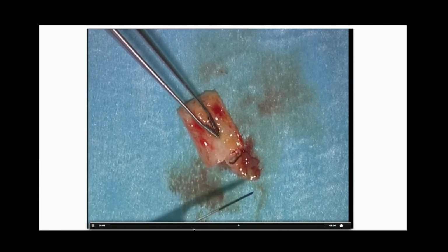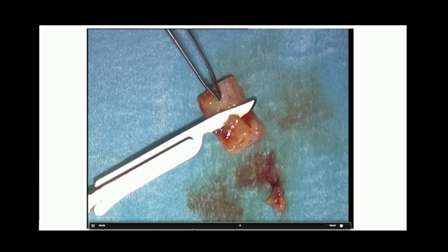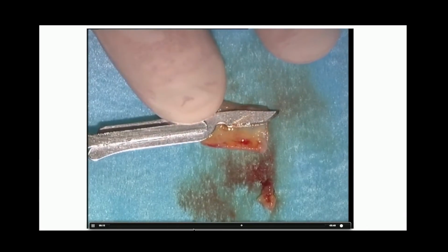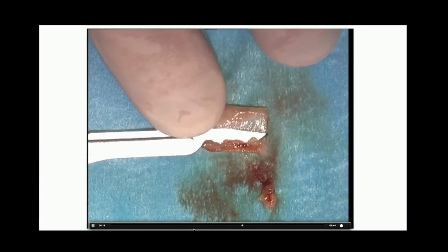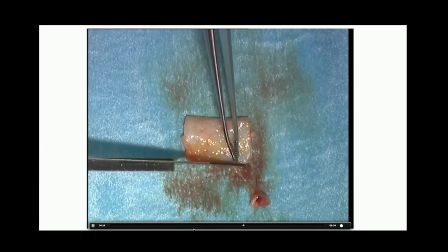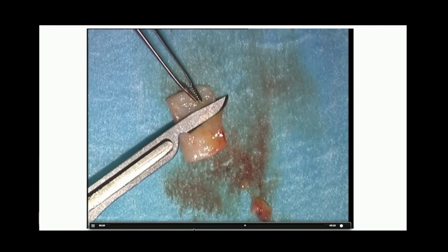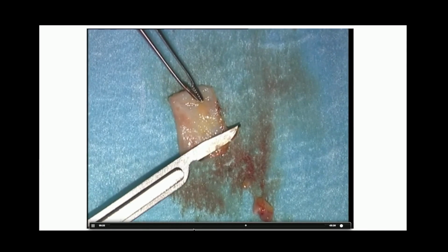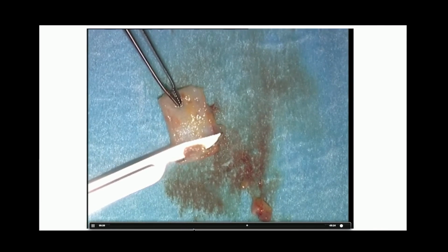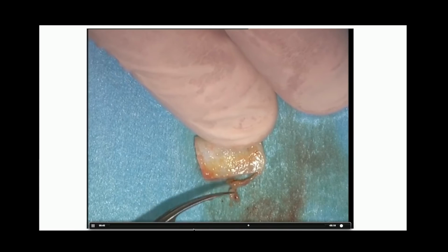As I mentioned before, the only real risk in this procedure, the risk of failure, is if we can't provide enough blood supply to the free gingival graft, and it ends up becoming necrotic. The only two possible mistakes are that I might not secure it properly and the suture could come loose, which would obviously mean losing the graft, or that I can't achieve a tight and stable adaptation between the inner side of the graft and the periosteum. So, in this case, improper stabilization of the free gingival graft increases the risk of necrosis.